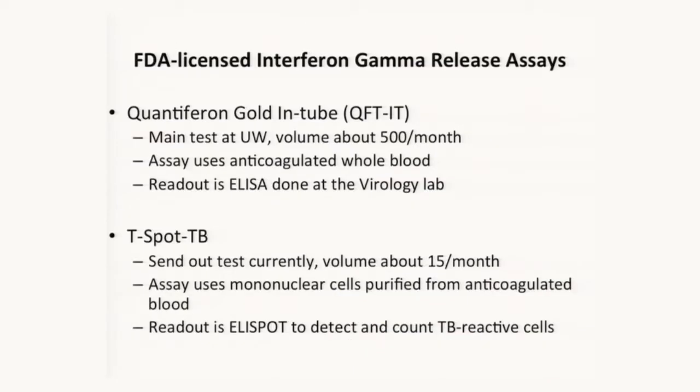So there are two FDA-approved interferon-gamma release assays, and we've been exploring using the other one, which I'm going to describe briefly now. I mentioned the QuantiFERON. That's the main one that we use. But there's another one that's an ELISpot. We're currently sending it out. We're sending out about 15 a month on these.